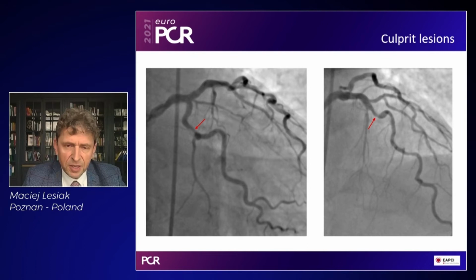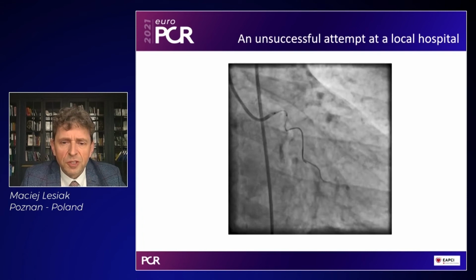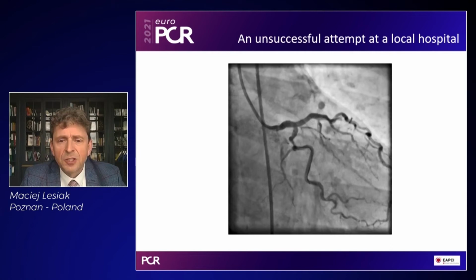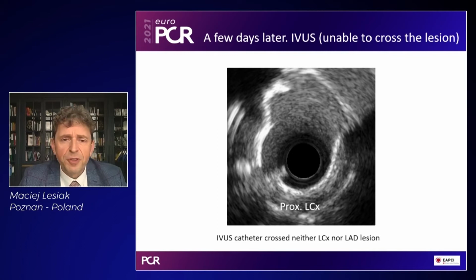And the operator in this local hospital attempted to fix it, but he failed. You see that he was not able to deliver even a small balloon over the buddy wires. So he used a buddy wire technique, and it was unsuccessful. So the patient was referred to my hospital, and a few days later, we did the procedure.